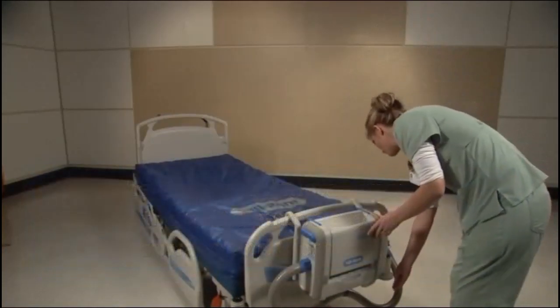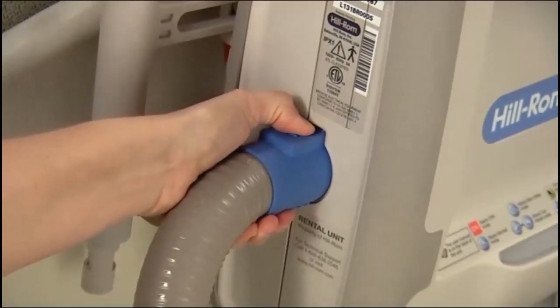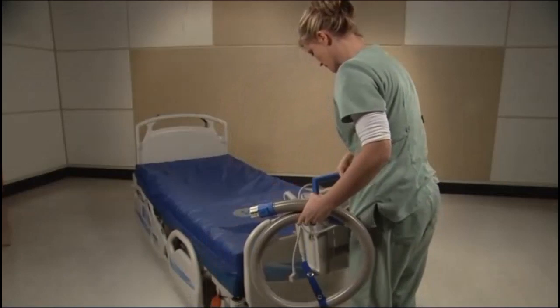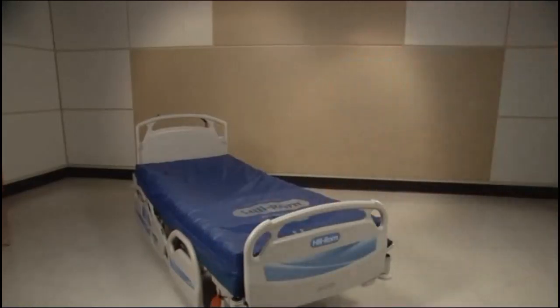Unplug the power cord and secure it with the control unit. Disconnect the hose from the surface and the control unit. Clean the unit thoroughly as described in the Clean and Disinfect section, along with any additional facility guidelines. Set the hose and control unit away from the surface.